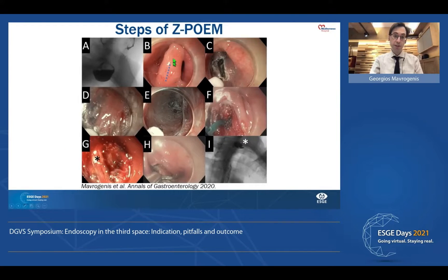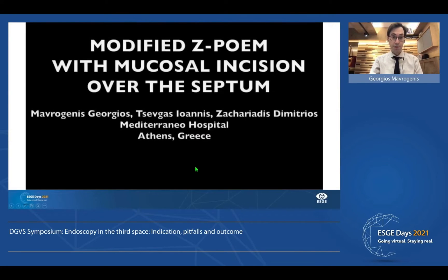The concept includes mucosotomy at the level of the septum, creation of the entrance, exposure of the septum, and creation of tunnels. This is one of the two tunnels, and then we perform complete myotomy of the septum. This is the final bundle of the septum, and then we close the entrance point.